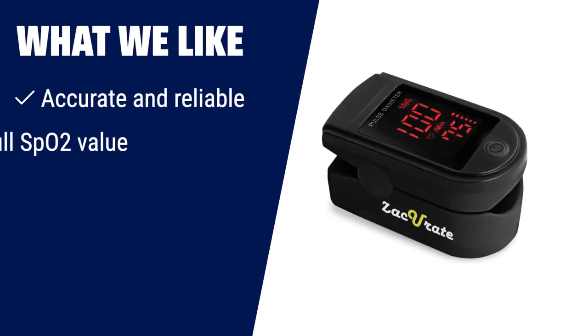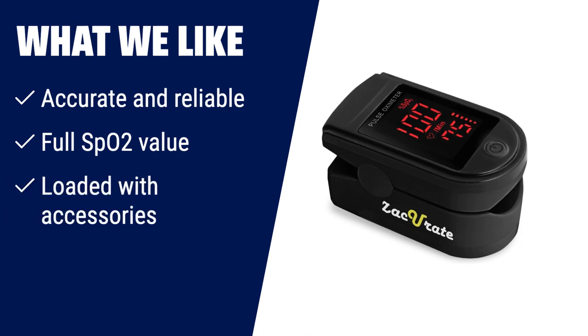What we like: if you are a sports or health enthusiast and need to monitor your SpO2 and pulse rate, the Zaccurate Pro Series 500 DL is the perfect choice for you. With its accurate readings and ability to display SpO2 up to 100%, this pulse oximeter will keep you informed about your oxygen saturation levels. Plus, it comes with accessories like batteries, a silicone cover, and a lanyard for added convenience.